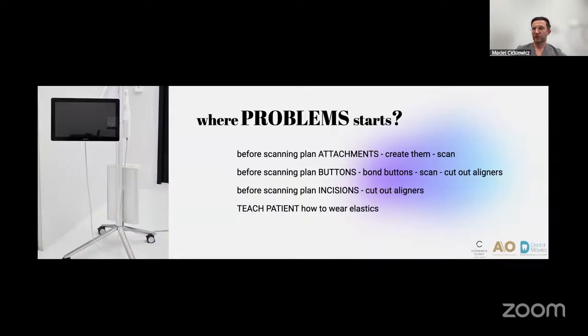So we do all the things together in this way, so we limit the additional time of our visits. So we can reduce the patients going through an additional appointment, then the patients go only through the reception. So the reception and then giving you only the aligners, and that's it.